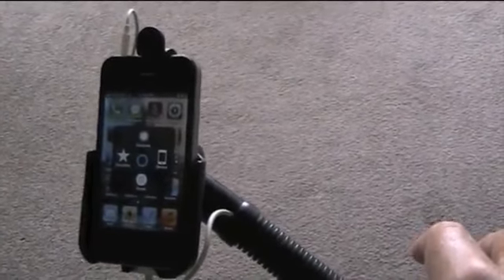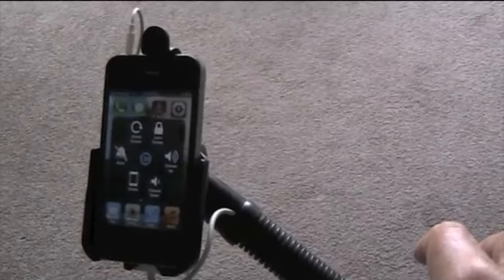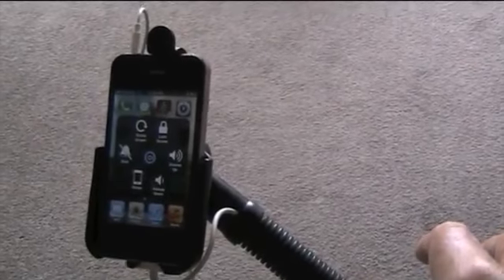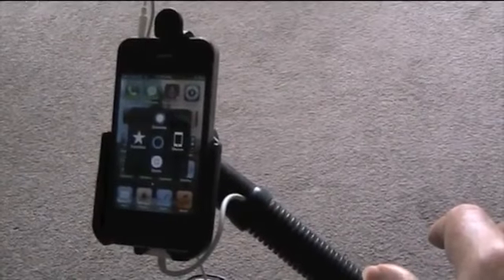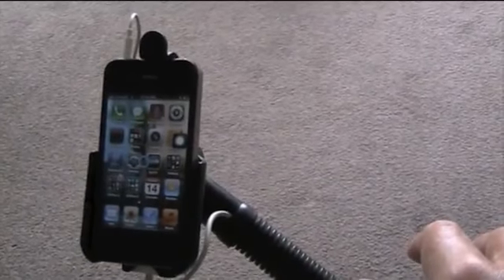Tap on the right hand pad again, brings up anything that I can do with the assistive touch. I can turn the volume up and down quickly, rotate the screen, mute the phone or lock the screen. And a touch on the right hand pad again takes me back to the main assistive touch menu, and a tap again moves the menu so I'm back to the home screen with all my apps.